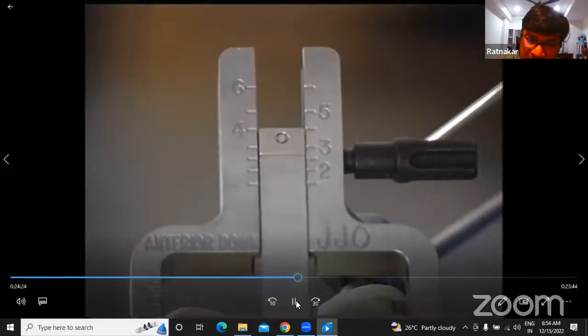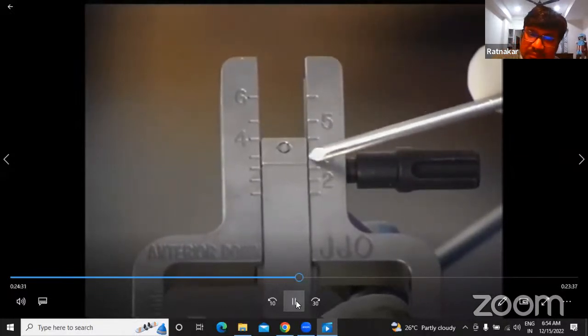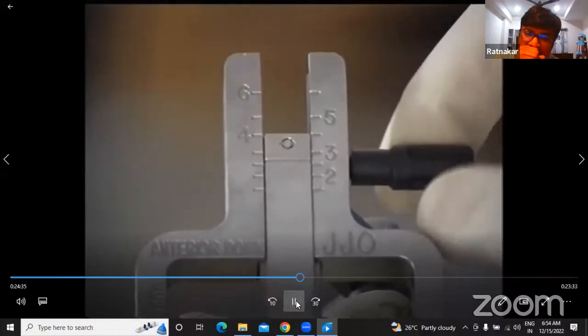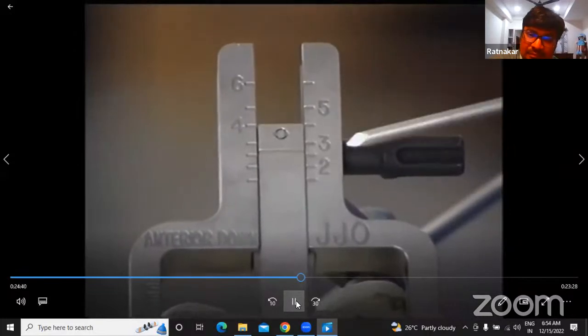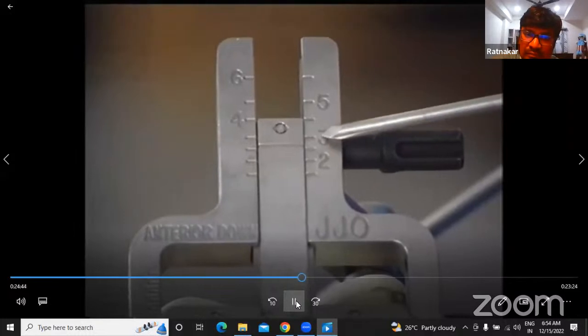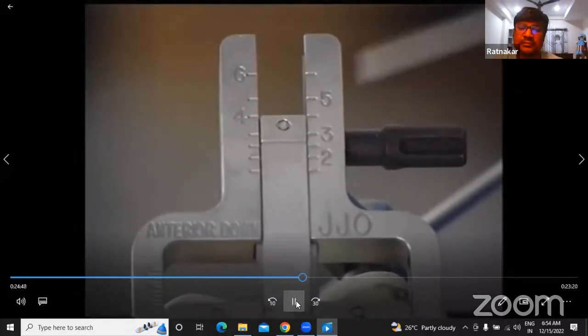Stylus there on the most lateral part of the anterior femoral cortex. This indicator is in between 2.5 and 3. So you've got to lock this knob there without moving anything. So now the dilemma is whether we have to go for 2.5 or to go for 3. The ideal way is to undersize it. That means you have to take 2.5.